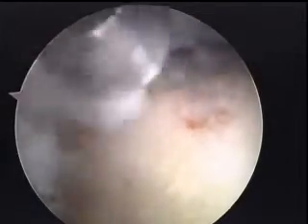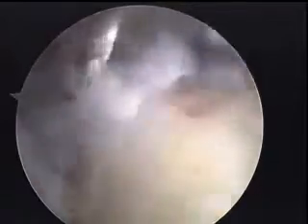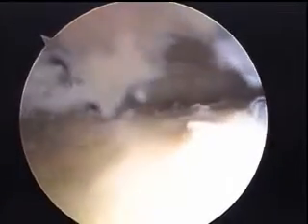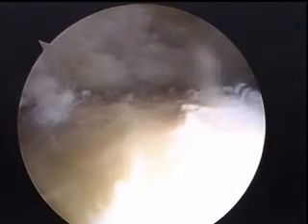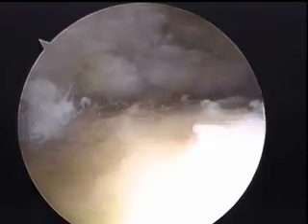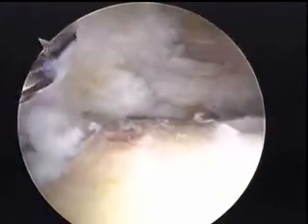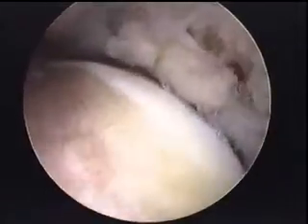As you can see, this is a pretty extensive process. That burr there is nearly 1/2 inch, and if you take that around every place we're going, we are getting probably about 50% around the neck throughout different ranges of motion. So that's a fairly significant area. You're looking at about a 2-inch width area right there, from where his impingement started down to the femoral neck.